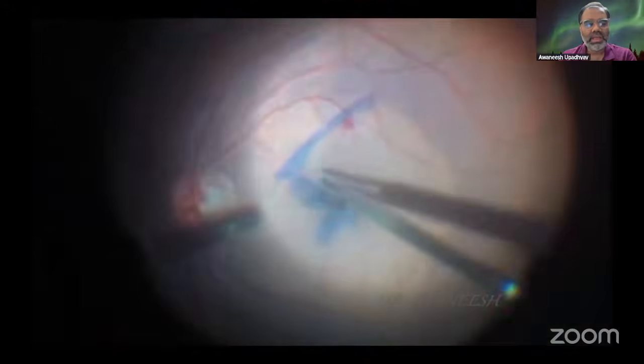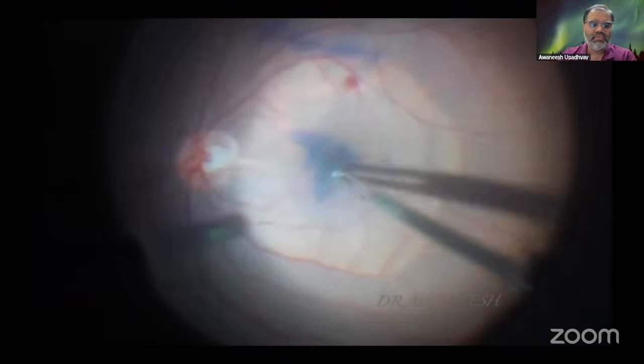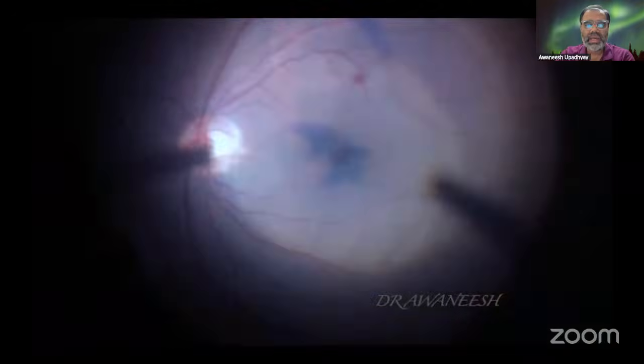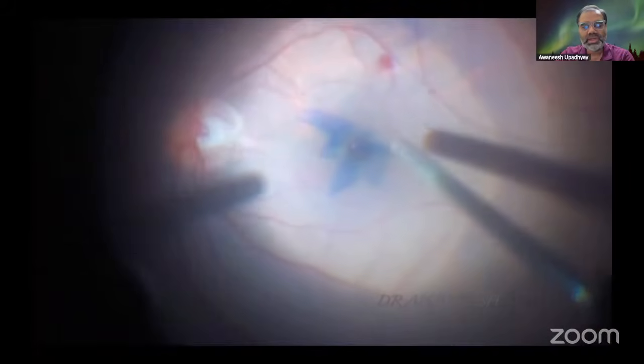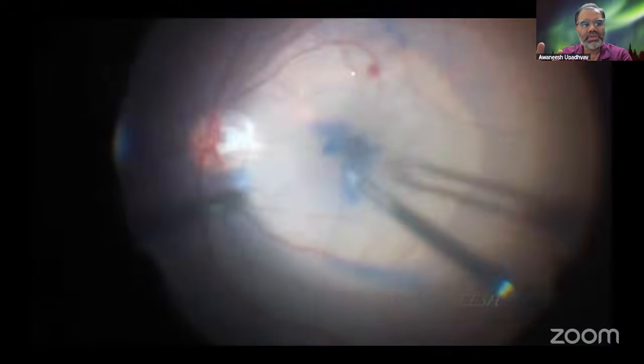Here, I trim the ILM flaps. What I would advise is one should use newer cutters. I use very low vacuum, say 50 to 100, and a high cut rate, so that the trimming is possible and the flap is not sucked into the cutter. Second thing, once those flaps are made, I use viscoelastic, and I try to place it over the surface of the fovea and then slowly scaffold it.